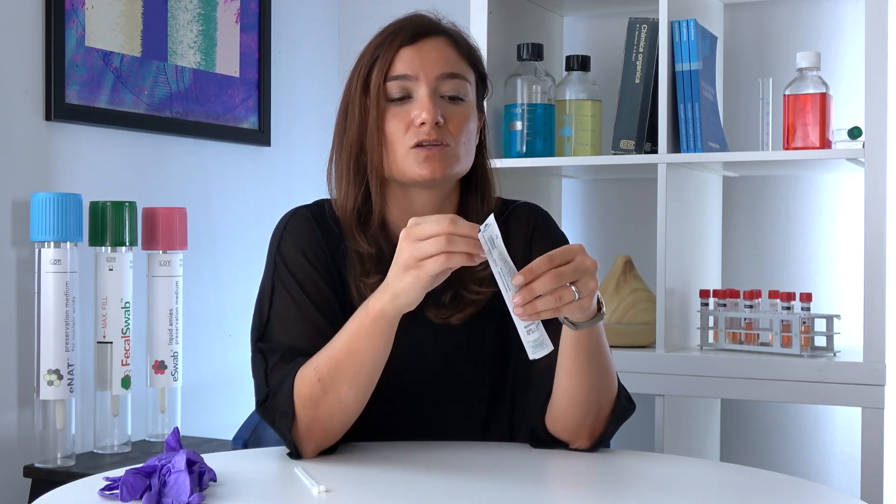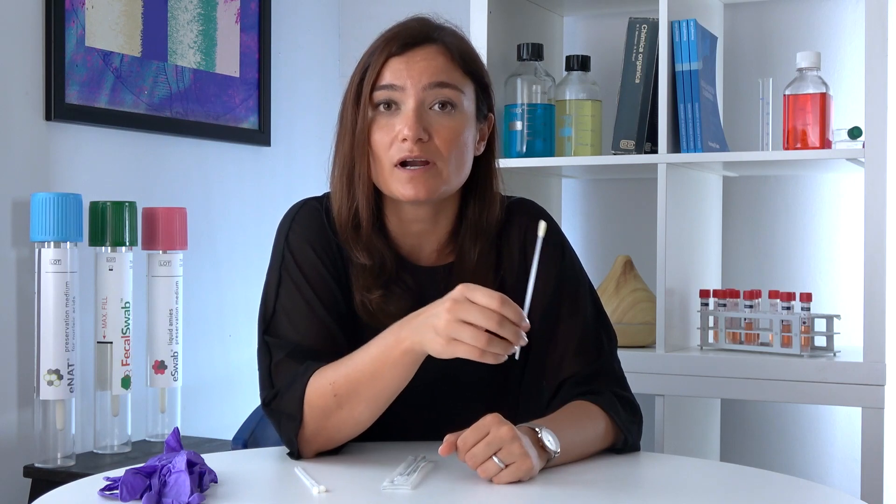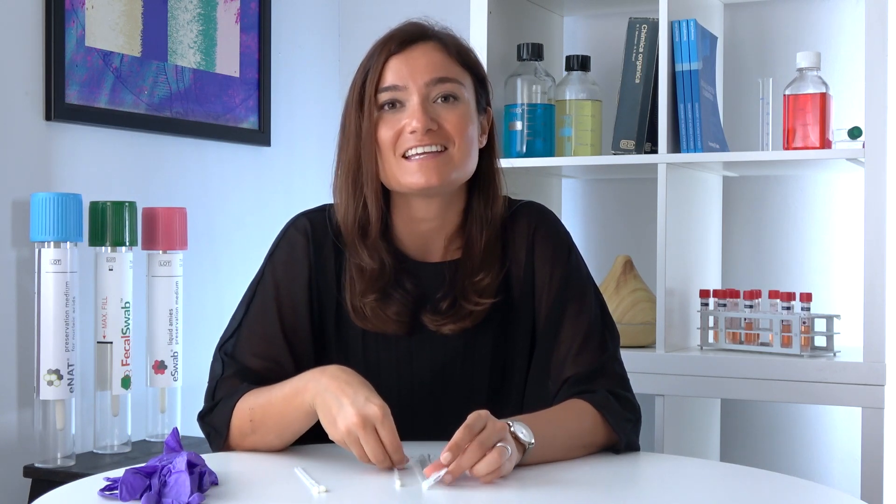Once your swab is out, you have to make sure that the tip doesn't touch any external surface before or after the diagnostic test. Once you're done, the swab is ready to be put back into a tube and sent to a diagnostic laboratory. And for today, this is all — I thank you for your attention and I look forward to seeing you in our next Copan Pill. Ciao a tutti!